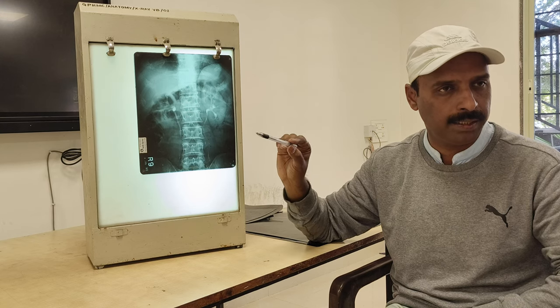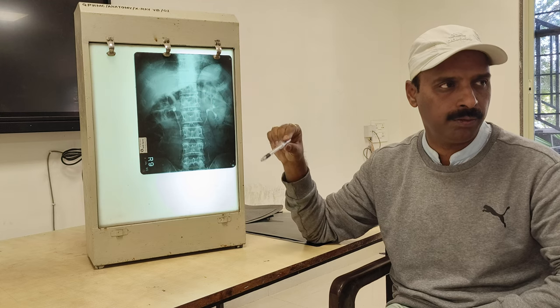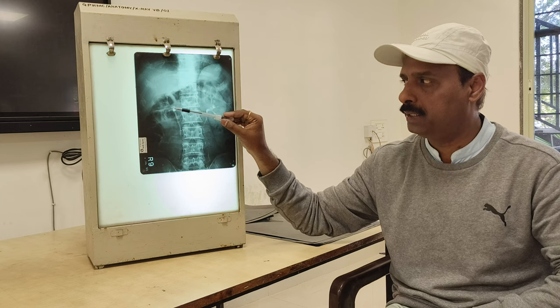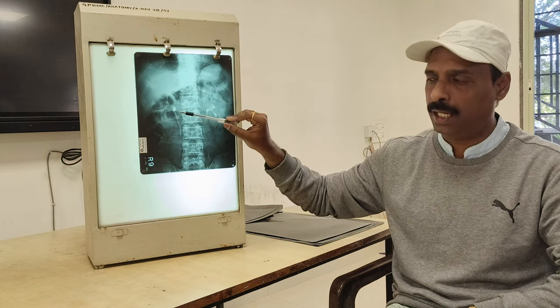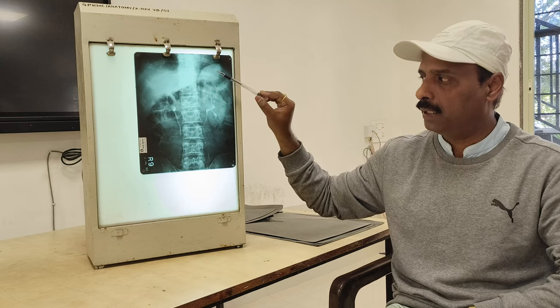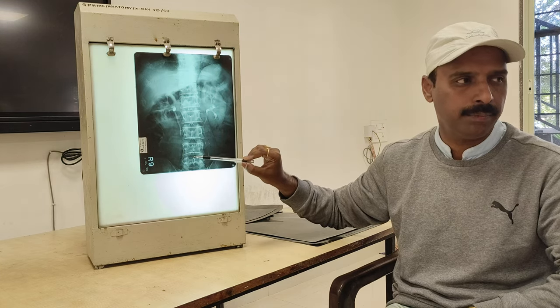It is a contrast variety of X-ray, and here the contrast media we use is iodine, a compound which is injected to give radiopaque imaging. So you have to tell the shadows of the right kidney and left kidney. These are the intestinal parts, and centrally you can see the vertebral column.